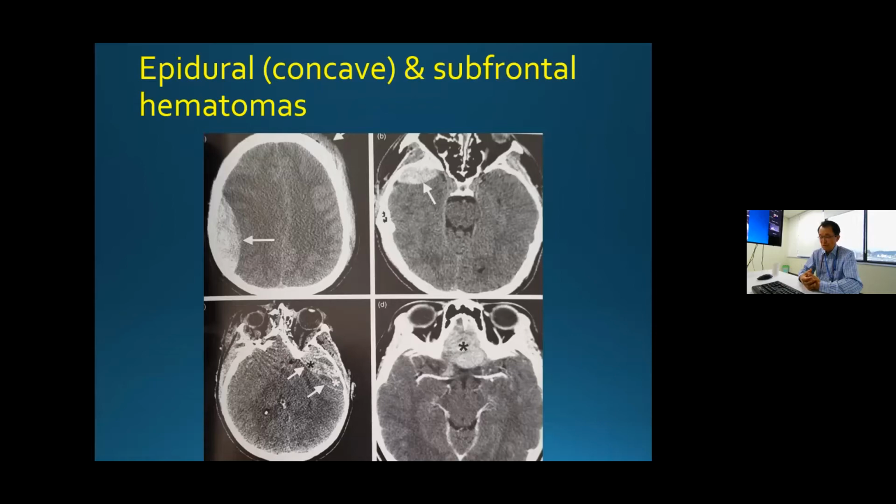In the United States, when you interpret PET-CT or PET-MRI, you are supposed to report any clinically significant, particularly dangerous or risky conditions from the CT or MRI. If you just interpret the PET scan and later find out there was a life-threatening disease, you are liable in the United States. Radiologists usually read both studies separately and make quite a lot of money together. But even in the nuclear medicine department, you have to recognize certain important diseases like this.